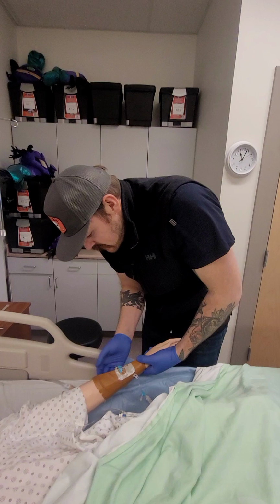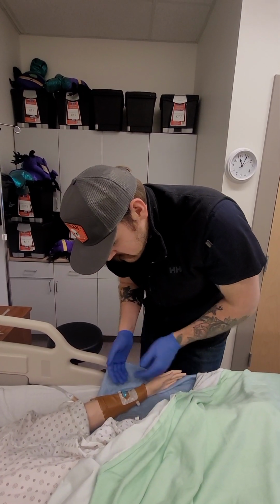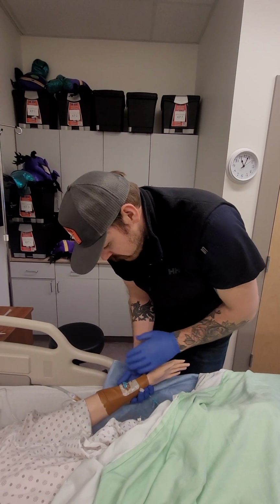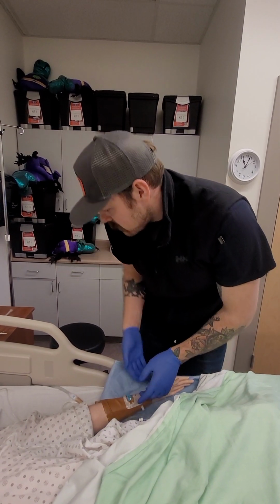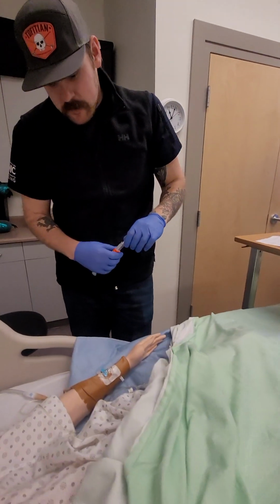I don't see any bulges. It doesn't look gross or blood filled or anything like that. So it's looking really good. I don't see any problems there. So why don't we go ahead and check for patency here.